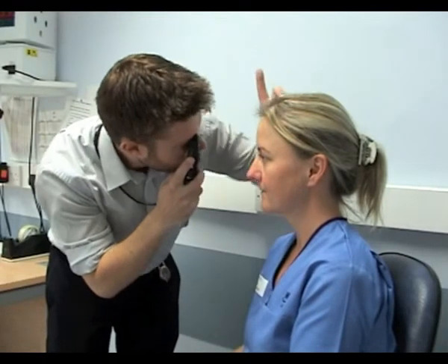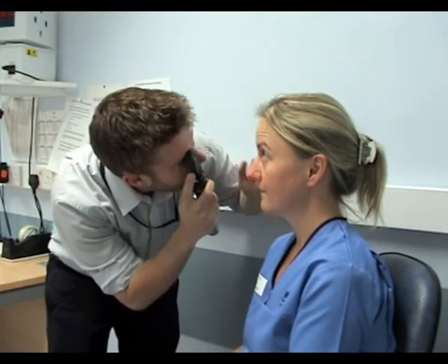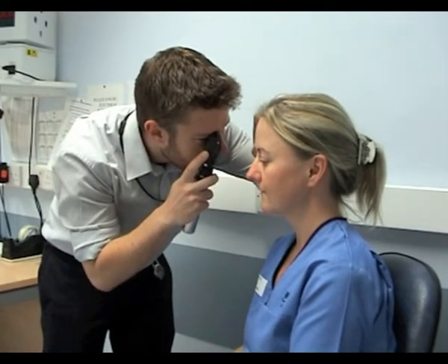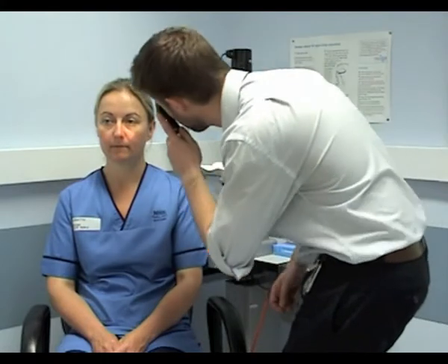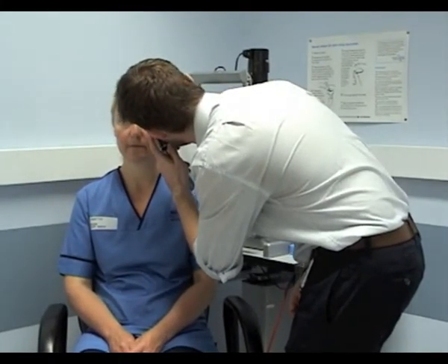It is important that when examining a portion of retina, one asks the patient to look in that direction and moves in the opposite direction. This brings the desired area into view and allows examination of more peripheral retina. Don't forget to use your left hand and left eye when examining the patient's left eye.